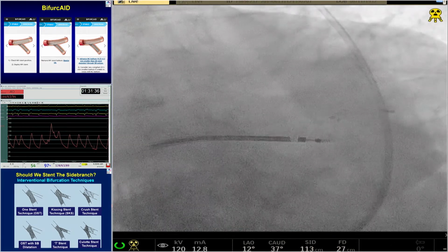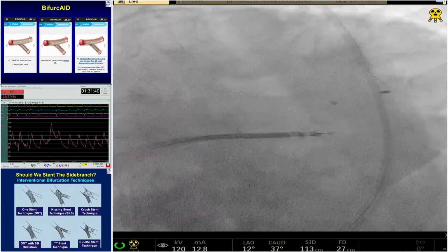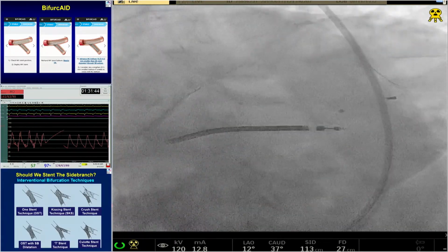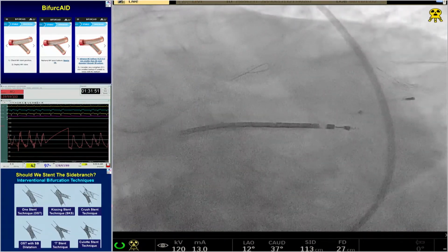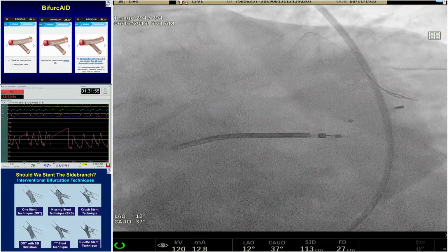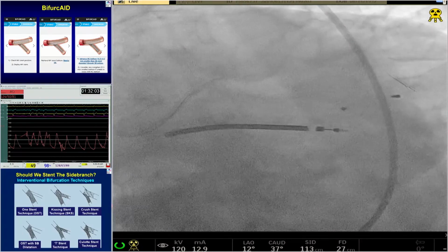That's interesting, because we're not seeing that. We're probably not seeing it mainly in the circ. But let's see who else has comments. Probably due to the motion of the angle. It was shown by Patrick Serruys that when you are putting 2 stents and the angle is not moving during the systole and diastole, this is a factor of restenosis. And what we see also, even in something longer but with time, is neoatheroma. This is a reality, probably related to abnormalities of flow and stress.